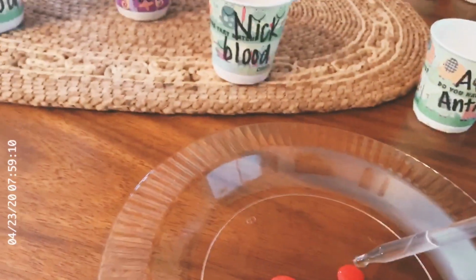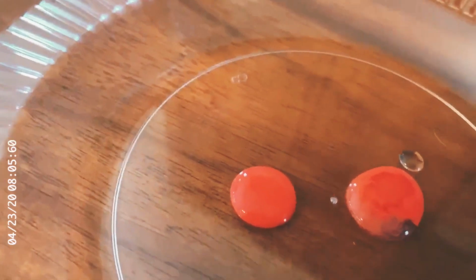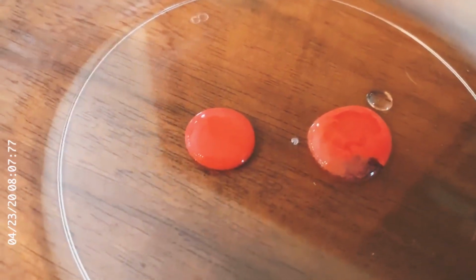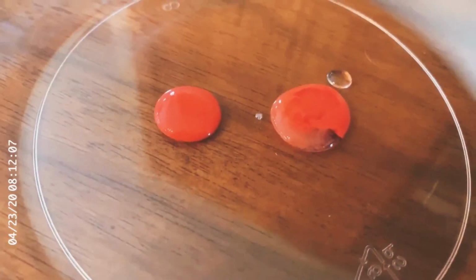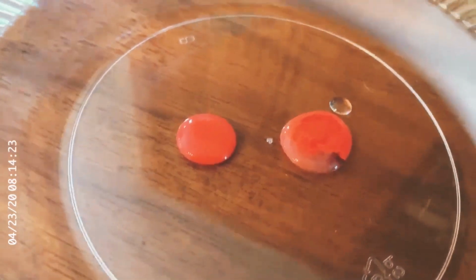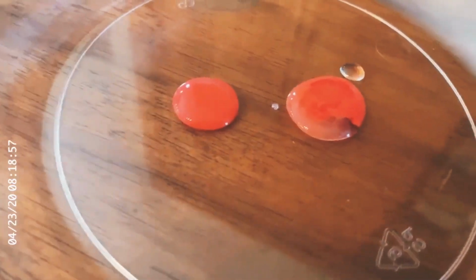Oop, gotta get it in the drop. And we're looking, again, clotting is positive and not clotting is negative. Not clotting just looks like liquid. Clotting is gonna look like it has, or it's not uniform. So that is Nick. So make sure you write positives and negatives for Nick.